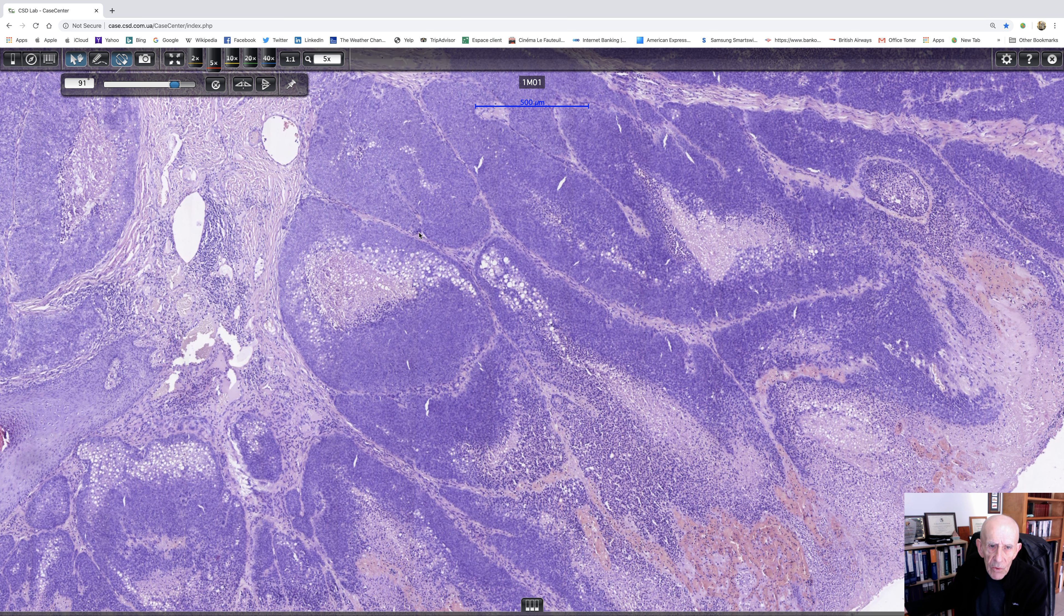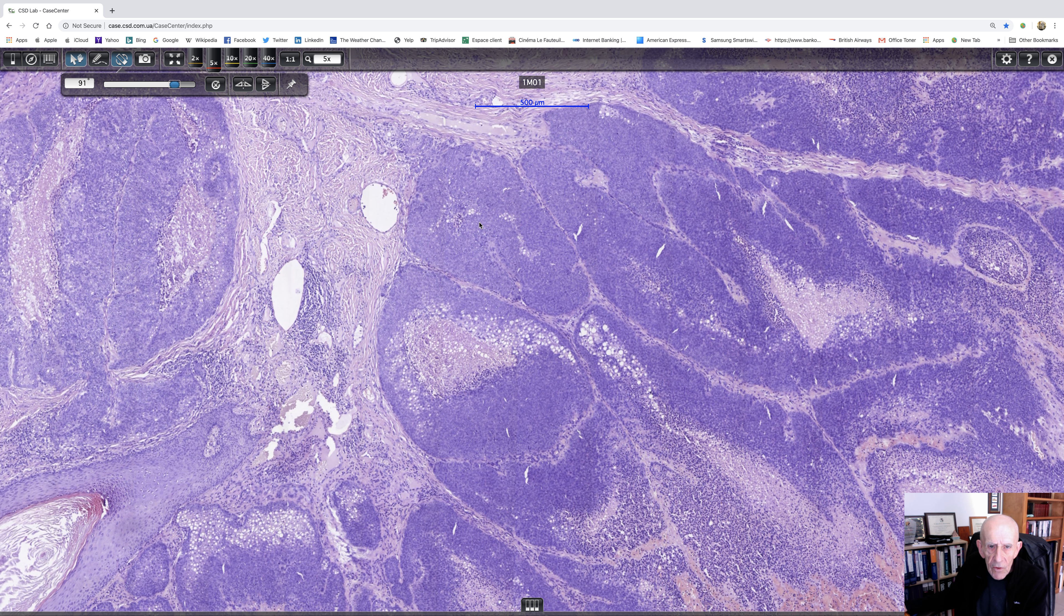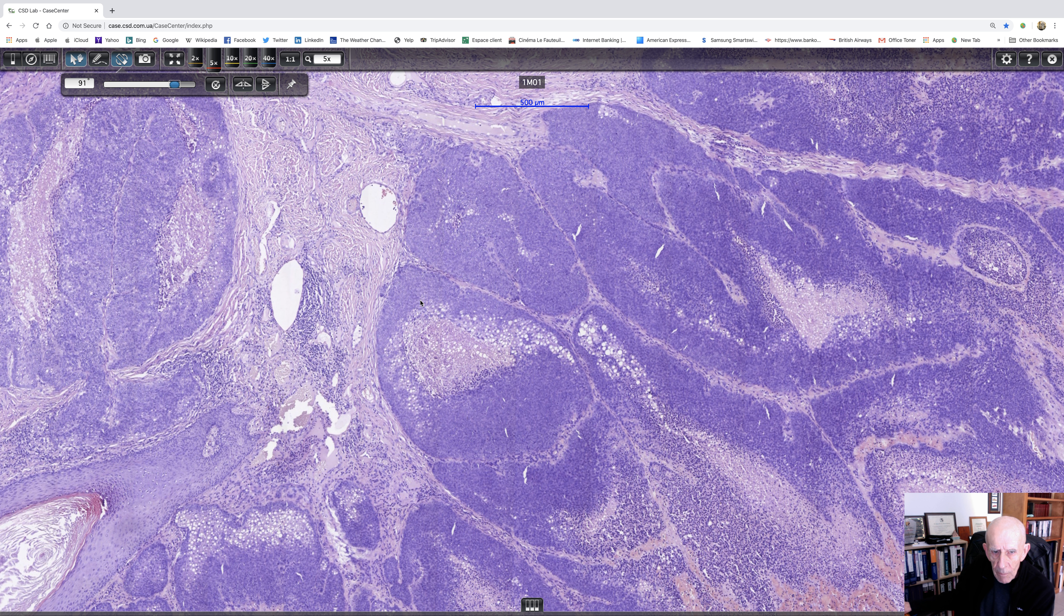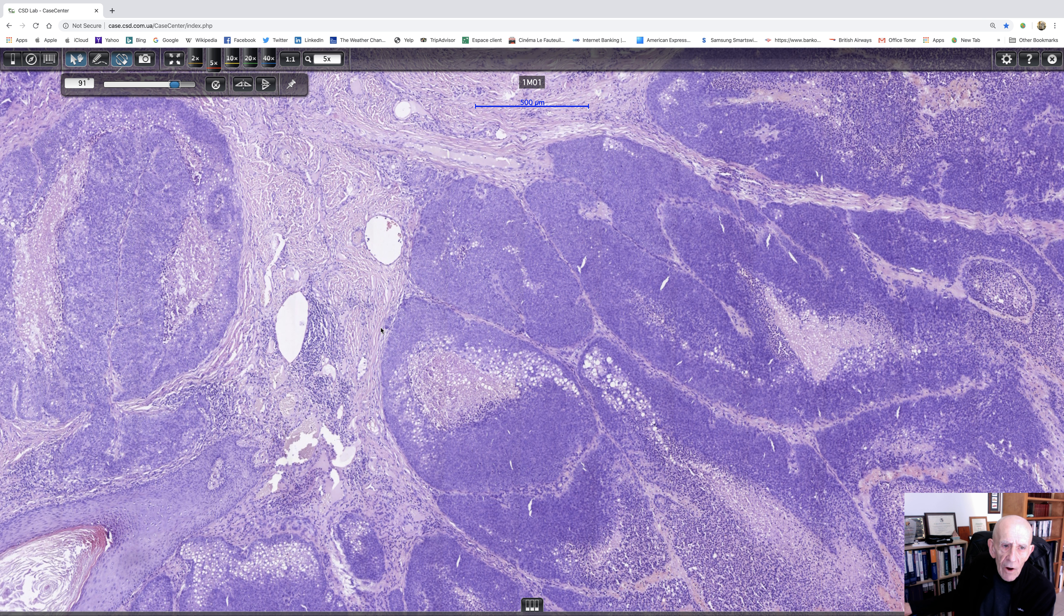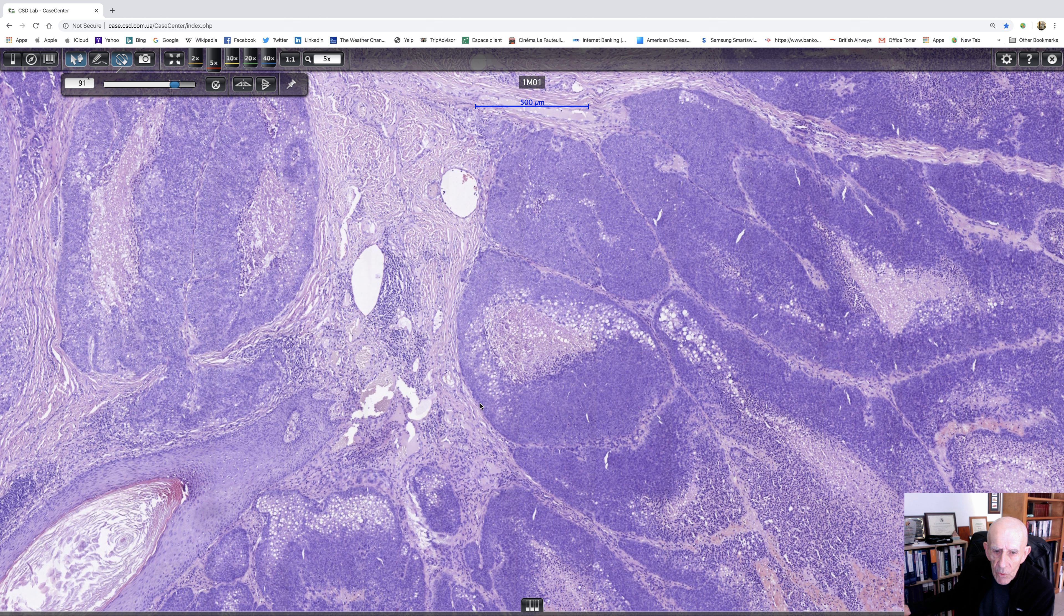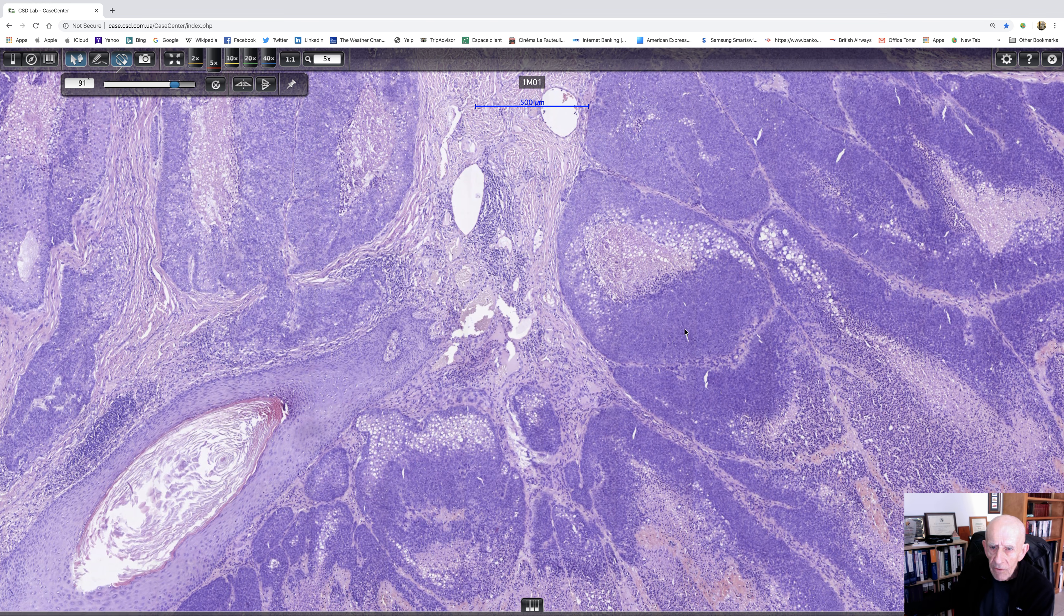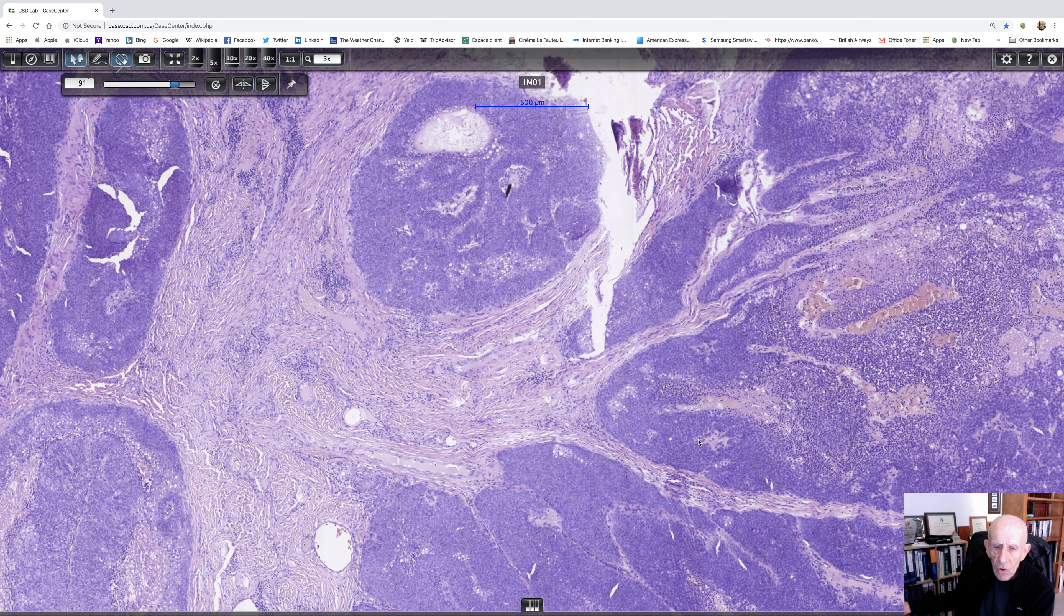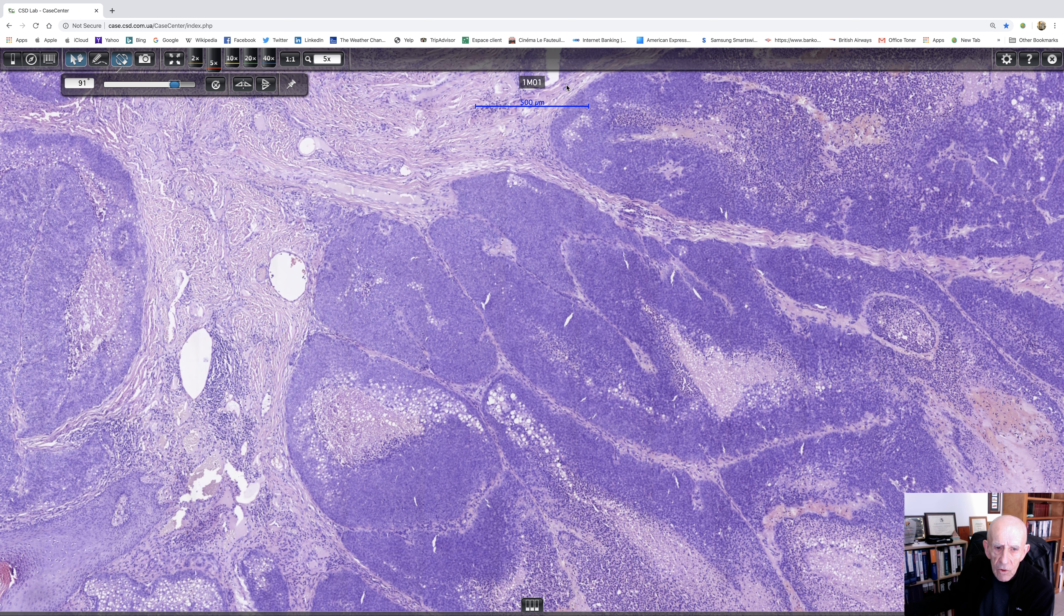So let's have a look and see if higher power can help us resolve that dilemma. Well, there you can see that there is vacuolation of these basaloid cells. There's also necrosis in the middle. So I think we know we're in the territory of a carcinoma. And what we don't see on this low power is we don't see really distinctive peripheral palisading and we don't see any retraction artifact with or without mucin. So I think basal cell carcinoma is going down and out of our differential. The other thing we don't see is there's no follicular specific stroma. This is just compressed dermis. It's not follicular stroma. So trichoblastoma is going out the window very quickly too.